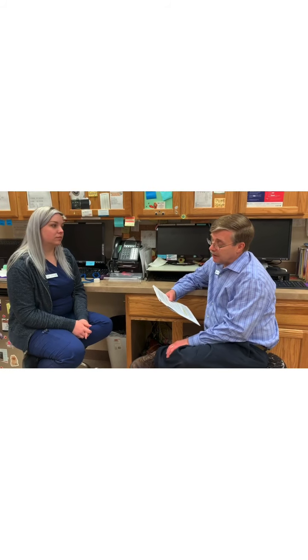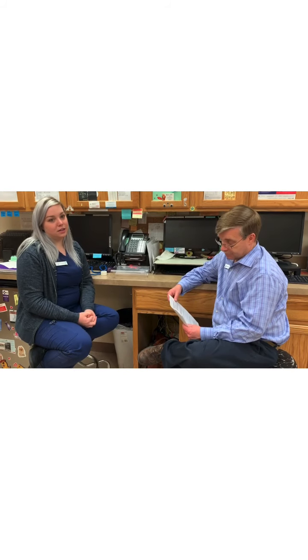Explain why no portion of any human, shielded or unshielded, should be exposed to the primary beam. The primary beam is very dangerous in that anytime you are physically in the primary beam, like with a hand or a finger or anything, that is being exposed to radiation. The PPE is just to help protect against scatter radiation, not protect against the primary beam that can cause significant damage to your skin and your cells.